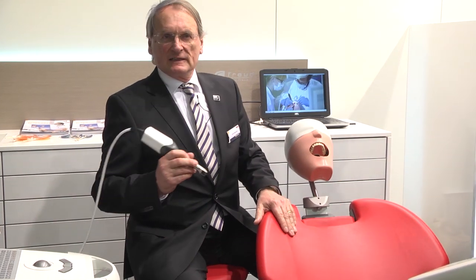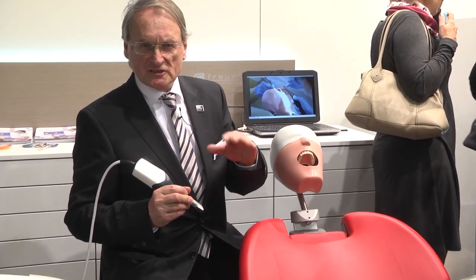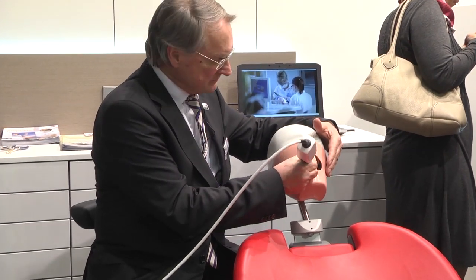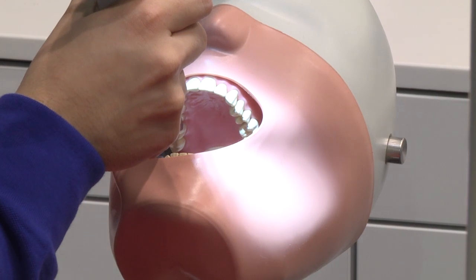With all of this together, I go to a dummy phantom head. I open the acquisition unit. I have registered my patient. I take my image from the restoration as well as from the neighboring teeth and the antagonist. I store the image inside the CEREC software and check it.